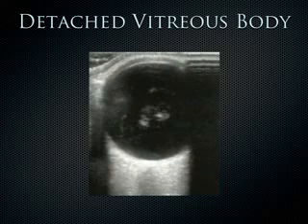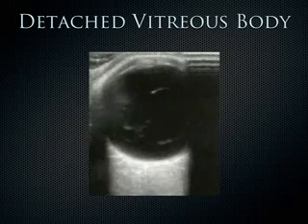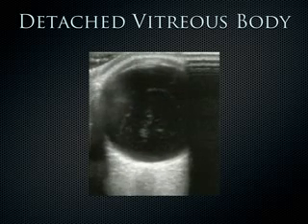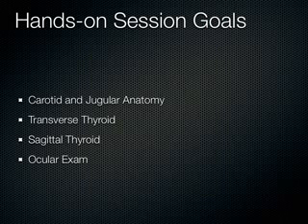All right, well, we threw a lot of pathology in this time. I tried not to do that, but I also think it's a lot of fun to kind of see some light at the end of the tunnel, pun intended. And when you get to the hands-on component, we're going to take a look at that carotid vasculature, the thyroid, maybe even do an ocular exam, and come along the bony landmarks on the face, and also look into the brain at the middle cerebral artery.